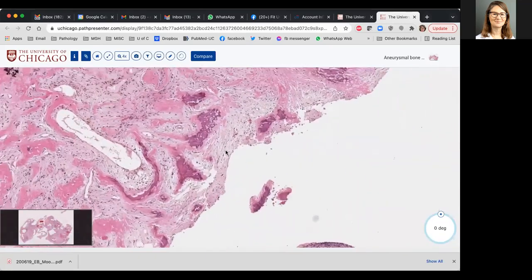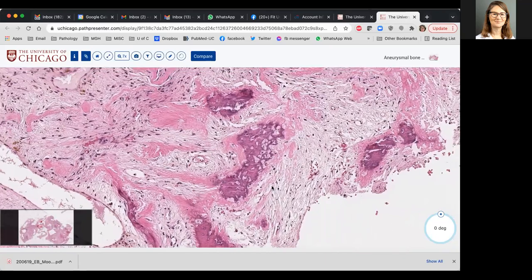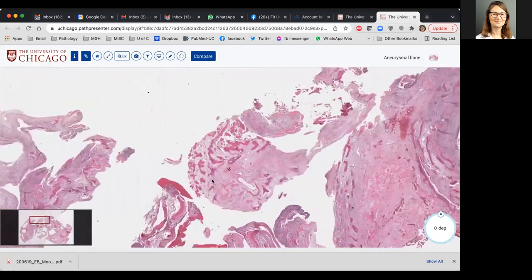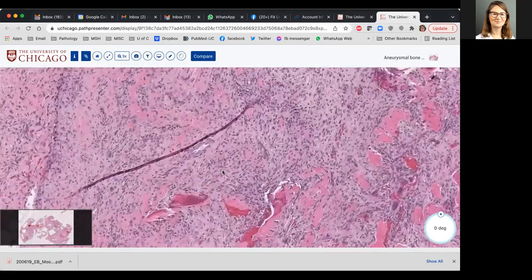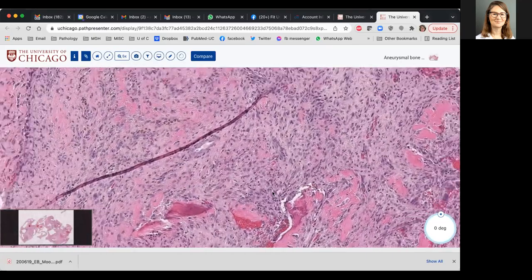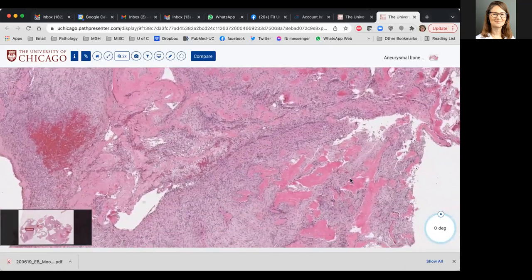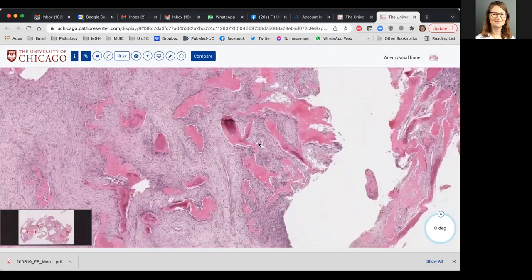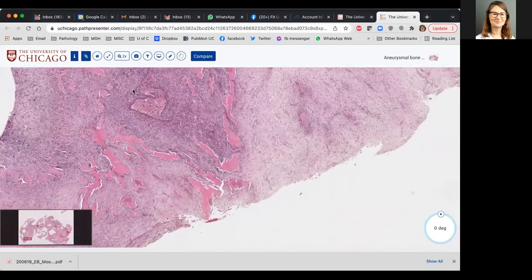Here's maybe a little bit, some bluish, kind of purplish bone. So that for me is the difference of an ABC, the background cells and the overall architecture. If you get lucky enough to find a little giant cell that's jumping off the cliff, you're very lucky.